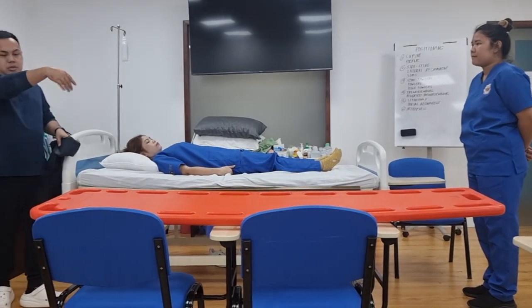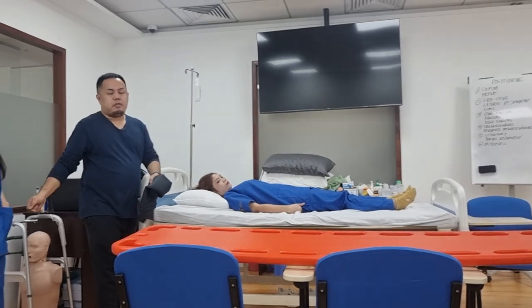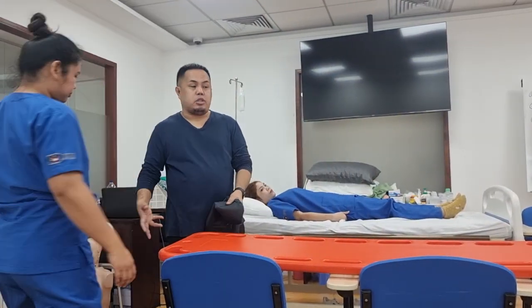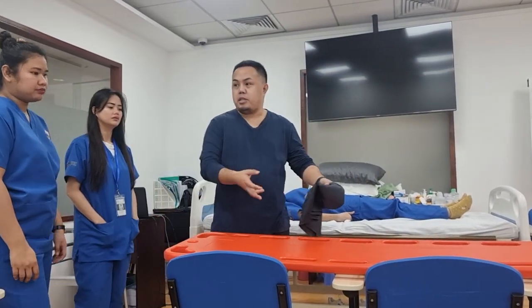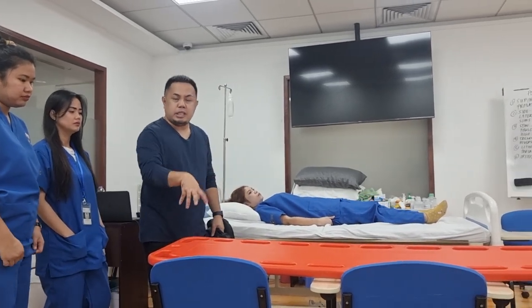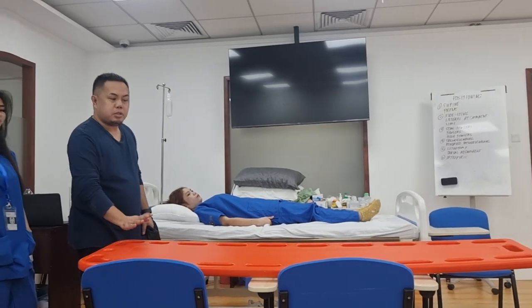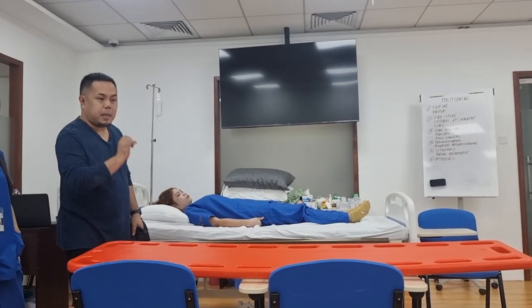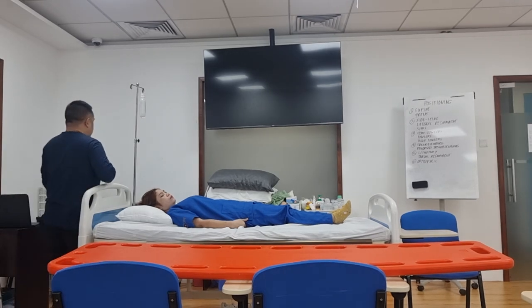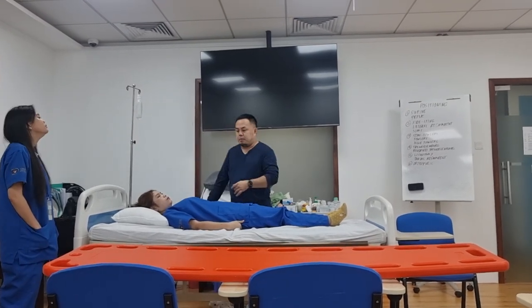So we will go together. We will have to move this wheelchair and the stretcher bed to the patient's room. Once the stretcher bed is already inside the patient's room, and the stretcher bed and slider board are ready, then I have to stand on the other side of the patient's bed.